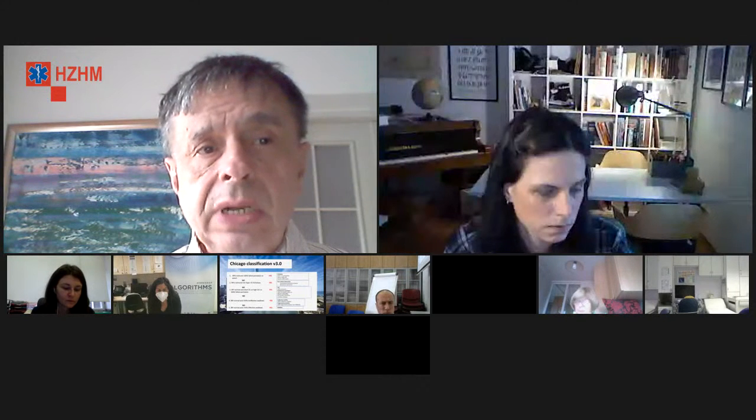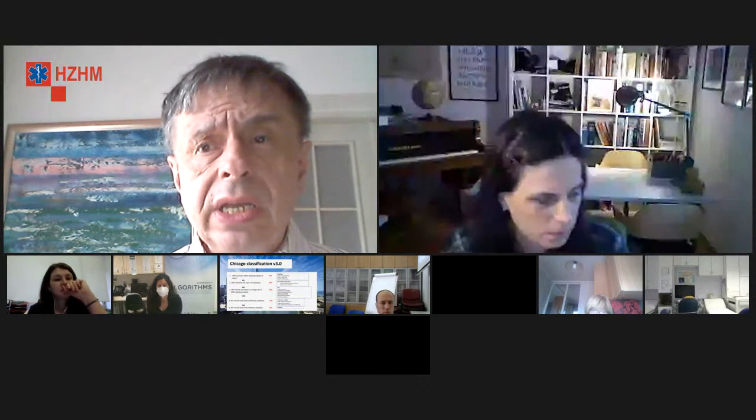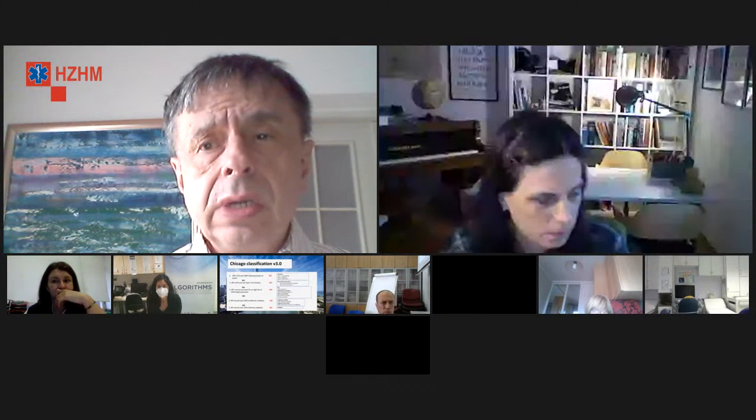Ono prvo što sam radio kad sam počeo raditi bila je dinamička scintigrafija jednjaka, gdje sam spojio dvije metode, dinamiku jednjaka sa scintigrafijom kod refluksa. Onda su došle ove manometrije, a isti problem je bio gore na Svetom Duhu, dok sam još bio tamo; profesor Jurčić je tada više bio na tom uređaju, i oni su dobili novi aparat.